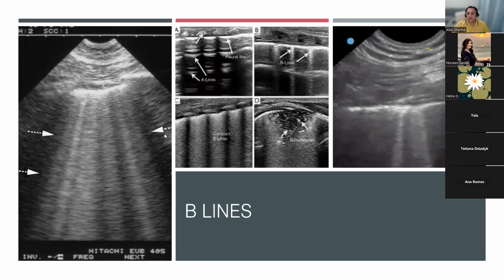Now, you're using ultrasound, which you can do in 90 seconds without radiation, with minimal handling in these babies, without having to move them a lot. There are so many advantages of being able to use ultrasound. I can do serial ultrasound. Now, to make a diagnosis of pneumothorax in a baby with TTN who's getting worse, I'm going to do an X-ray now. I might end up repeating another X-ray. Then I'm putting a drain in. I'm repeating another X-ray. Then I want to see the drain position if it's too far. So I might end up exposing this baby to 4 or 5 X-rays to make the diagnosis. I can do serial lung ultrasounds and make that diagnosis without exposing the baby to handling and a lot of radiation.